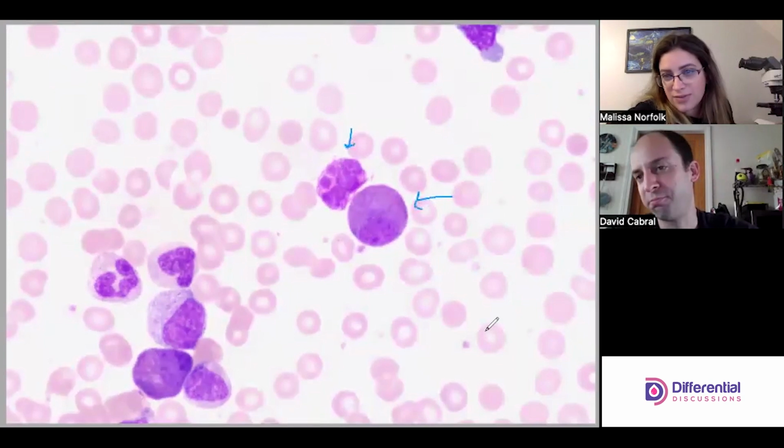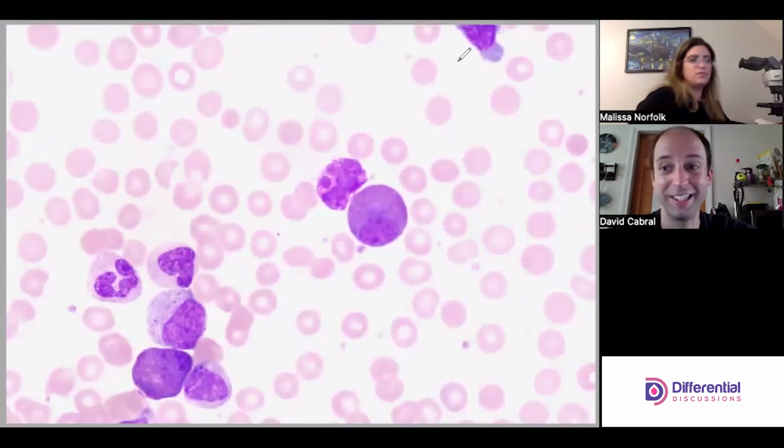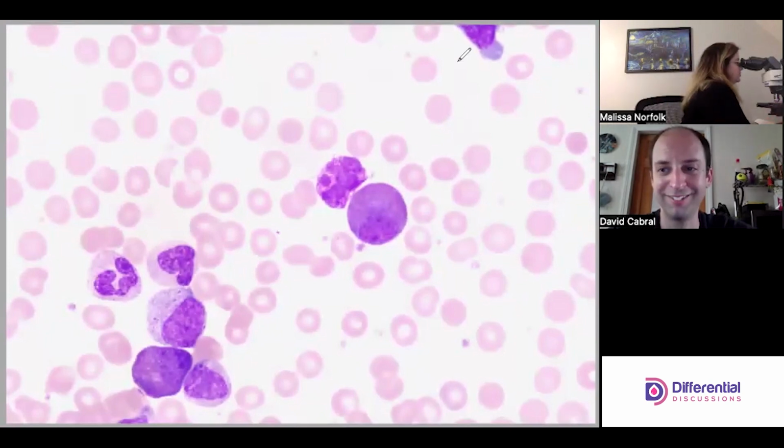Well, I apologize, I'm being overly broad. I think it's an immature EO. Yeah, I agree. I'm taking the easy way out. Be easy about it. Yeah, sure.